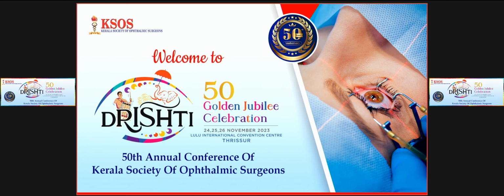It is very difficult actually to do SICS with iris hooks, but for recording purposes, see, in SICS I might do small sphincterotomies and do it. Sphincterotomies for a phaco might cause trouble because the iris pupillary margin might become floppy at that time, but for SICS, it doesn't matter. And if it is a very stiff pupil, you put iris hooks, you'll have small sphincter tears. SICS, I have done. The important point there is, when you do the nucleus delivery, release it. Otherwise, it is going to be a mess.